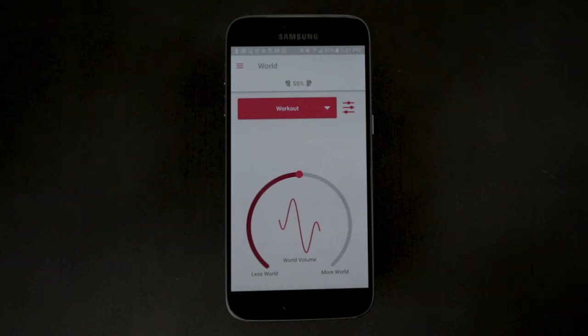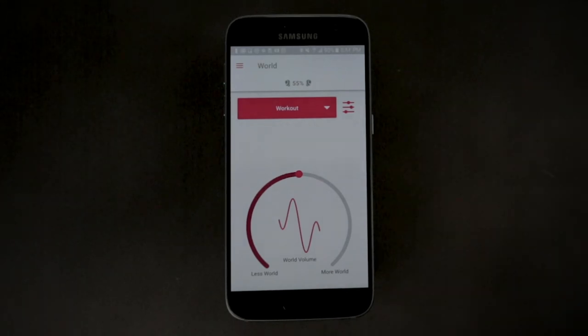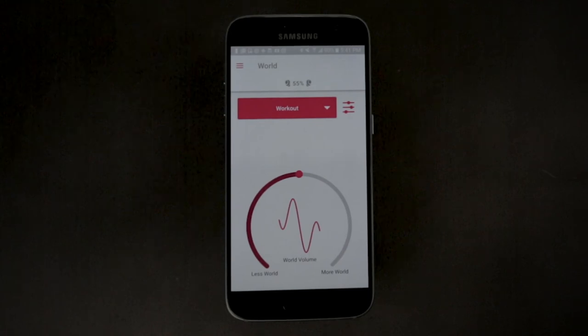If in noisy environments, the noise level can be controlled using the Sync or Live EQ wheel rather than increasing the real-world volume.